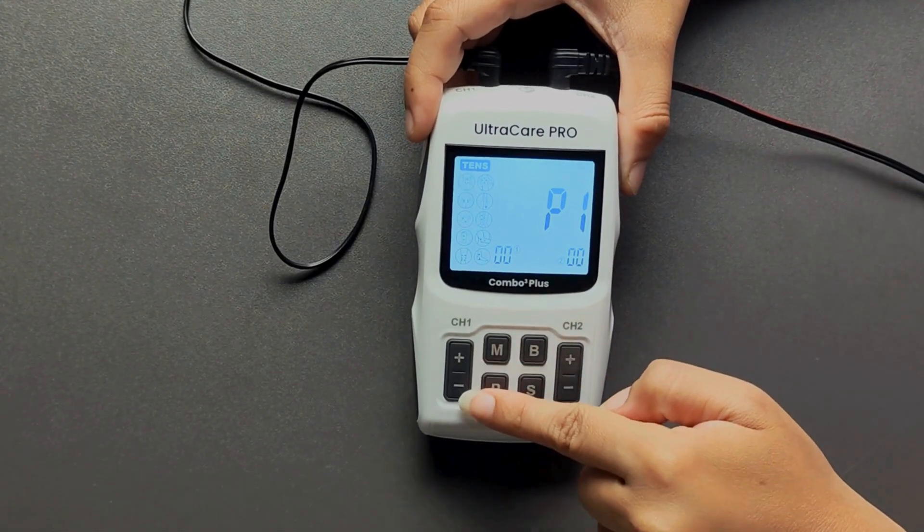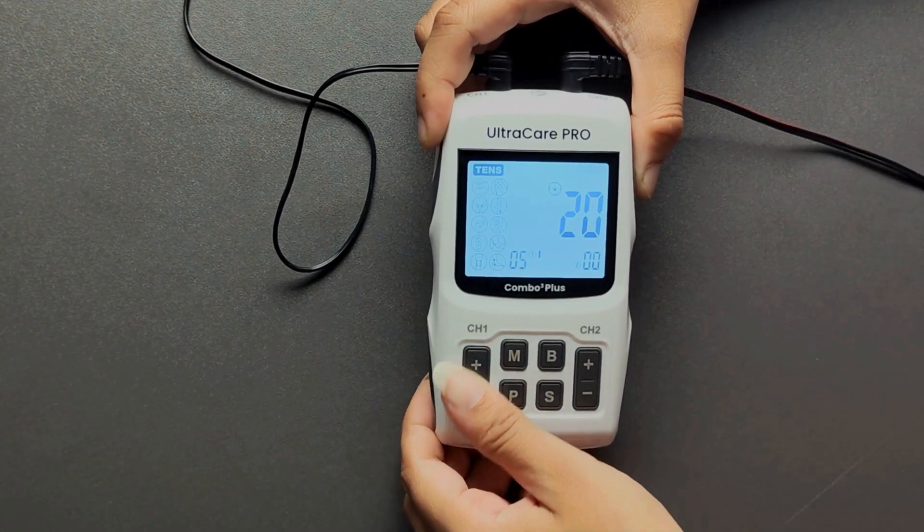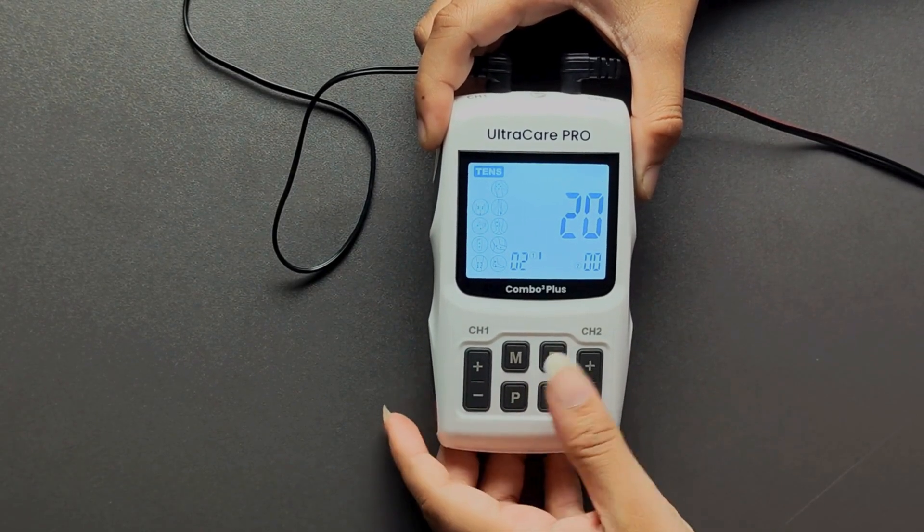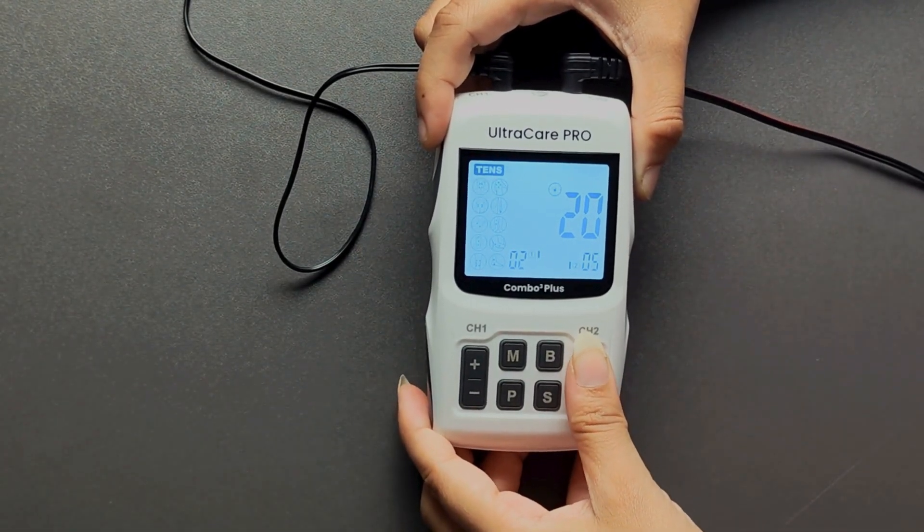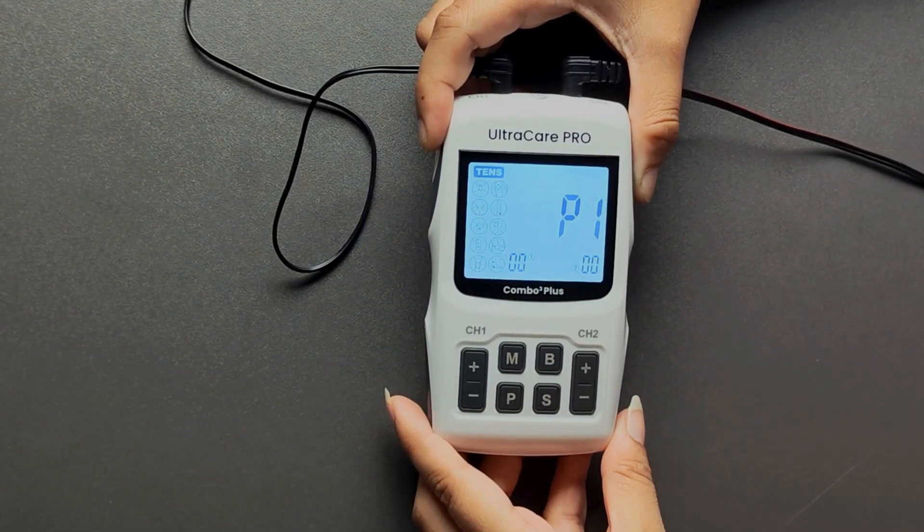During the treatment, you can adjust the intensity for channels 1 and 2 using plus and minus buttons. The intensity can be set between 00 to 90 for TENS, EMS, and Russian current therapy and between 00 to 60 for IFT mode.